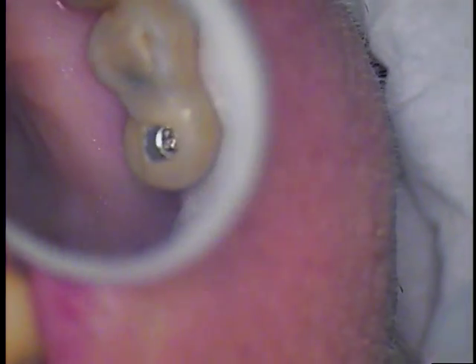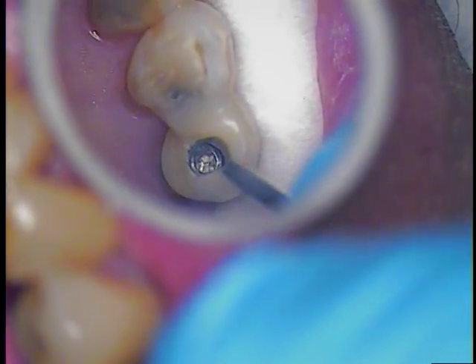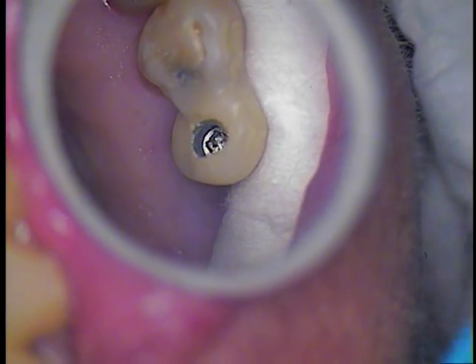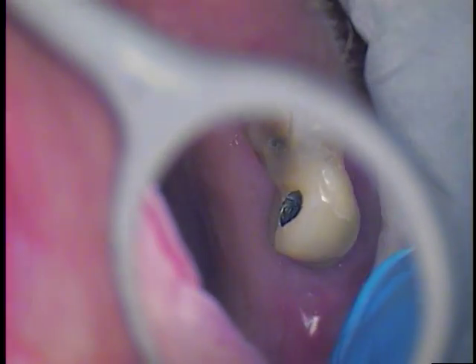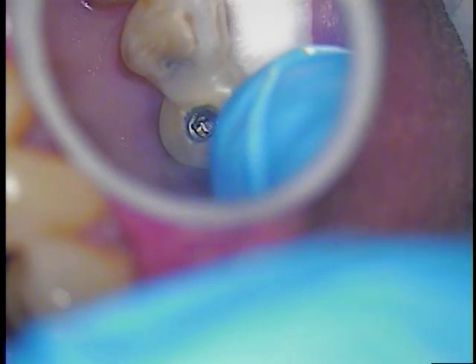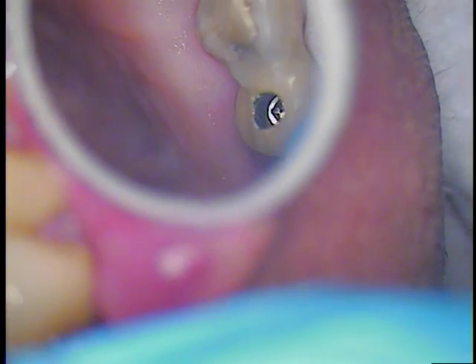That's the other problem. If the screw head can't come straight out so that it comes away from the abutment and the fixture — that's the limit. That means the screw head... we're hoping that all the threads are now undone. And once I remove the bonding, it all comes off. If not, I've got to re-bond this again and take part of the head of the screw off in order to make it come up a little bit more. So, it gets a little complicated now.